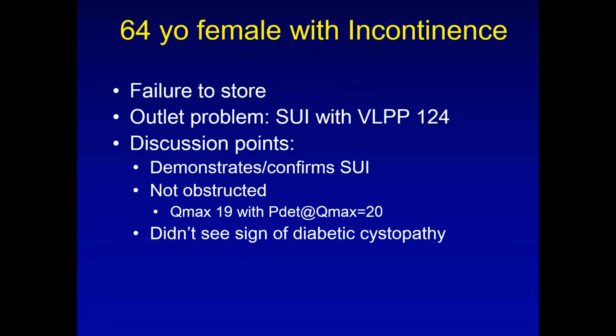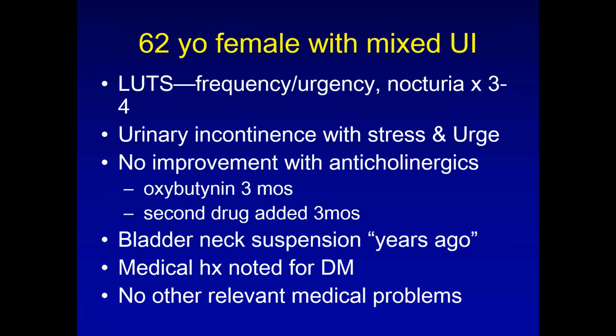A 62-year-old female with mixed incontinence. We're almost done. I think I got one more case after this one, and that's actually another good case. Frequency, urgency, wakes up 4 times a night. She's got urge and stress.